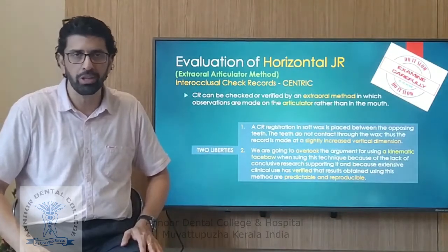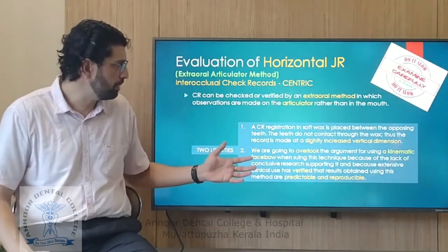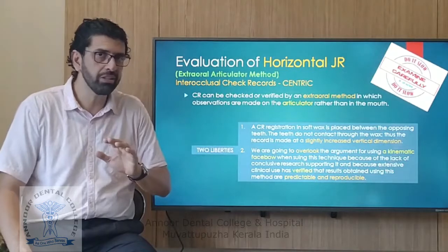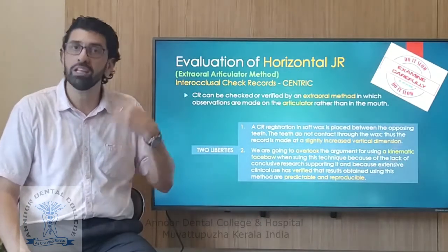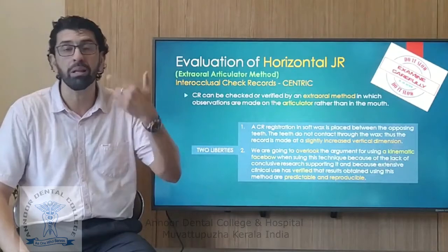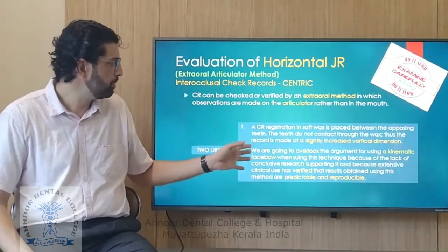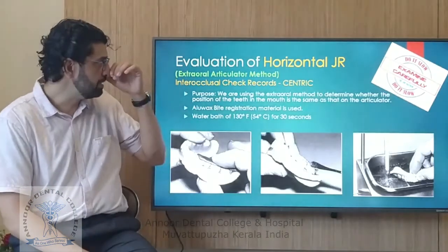Yes and no, okay, because we're going to overlook that argument primarily because, see, there's no conclusive evidence saying that is the state of affairs. Number two, because clinical practice over years has proven that this gives repeatable and predictable results. For this reason, we're just going to go ahead and take this liberty and do this step. Okay, so it's very simple.